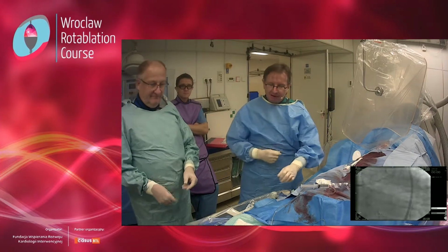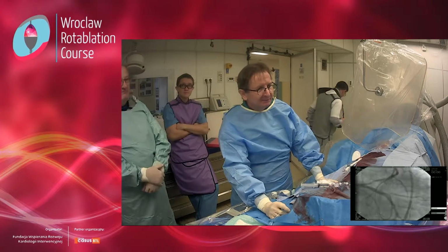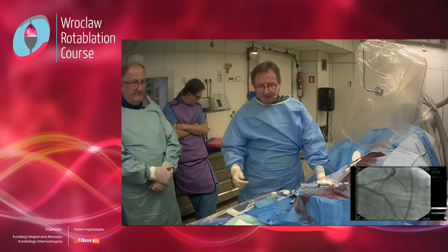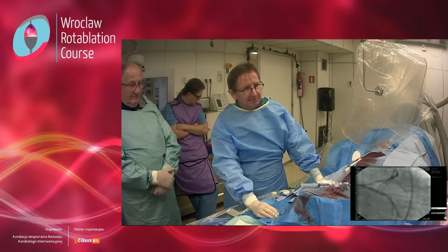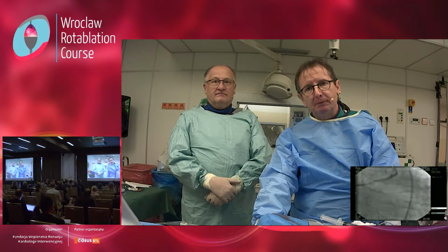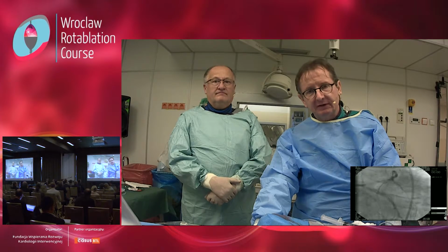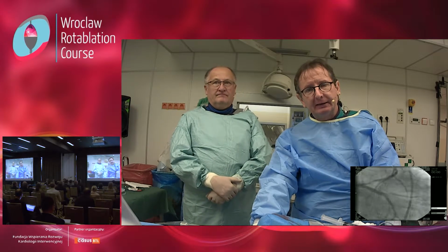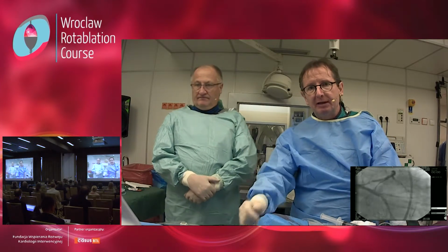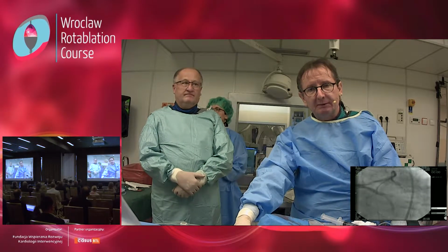Hi. So welcome from the cath lab here, and with me is Maciek Telichowski. We perform many cases together, so we are an experienced team, and we plan to do a long LAD rotablation. It's a long lesion of calcified LAD, and we plan to do this using femoral approach, 7 French. Patient is on hemodialysis, so it's clear we should go using femoral approach.